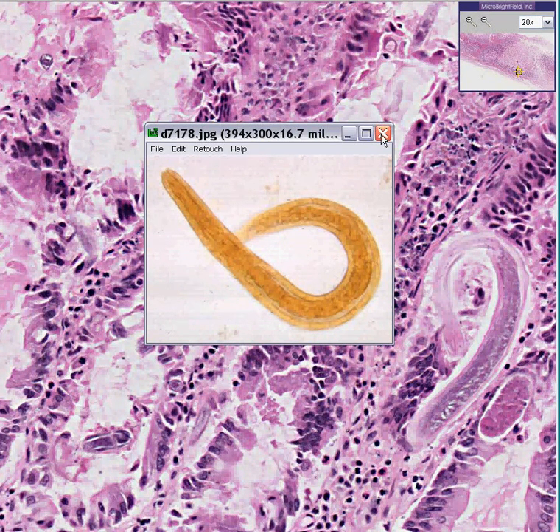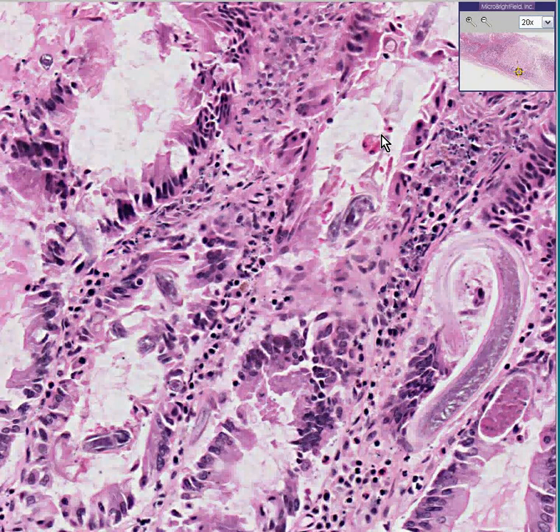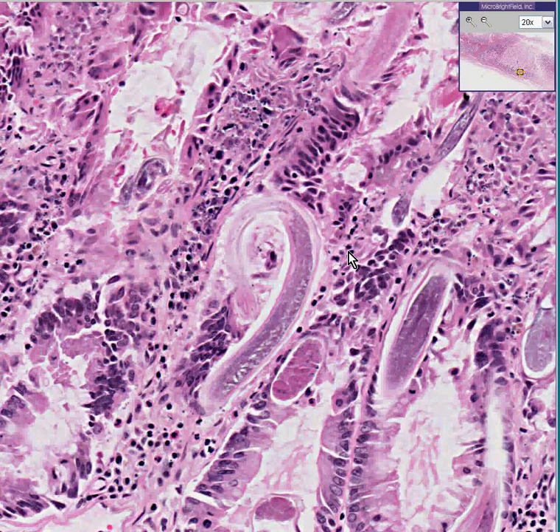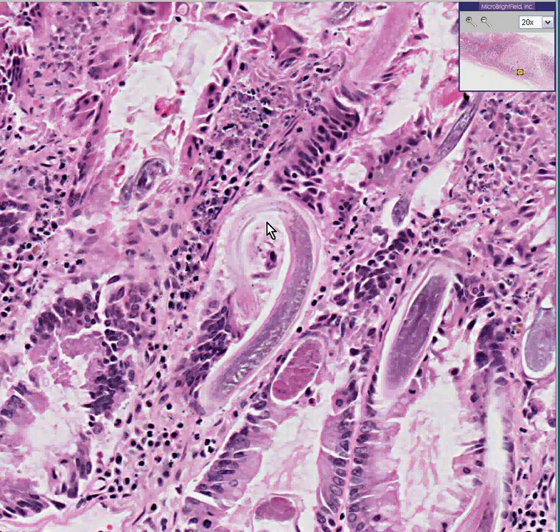You may not see this ever in your life, but if you do, I bet you'll recognize it instantly — because nothing else looks like a worm within the small bowel than a worm in the small bowel. And the most common type of worm in the small bowel worldwide would be Strongyloides stercoralis.